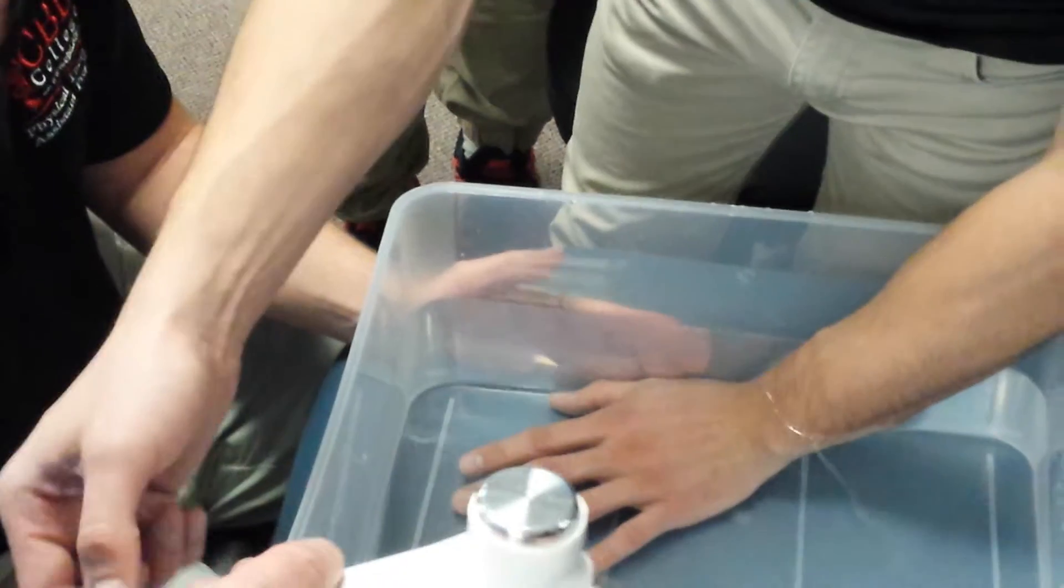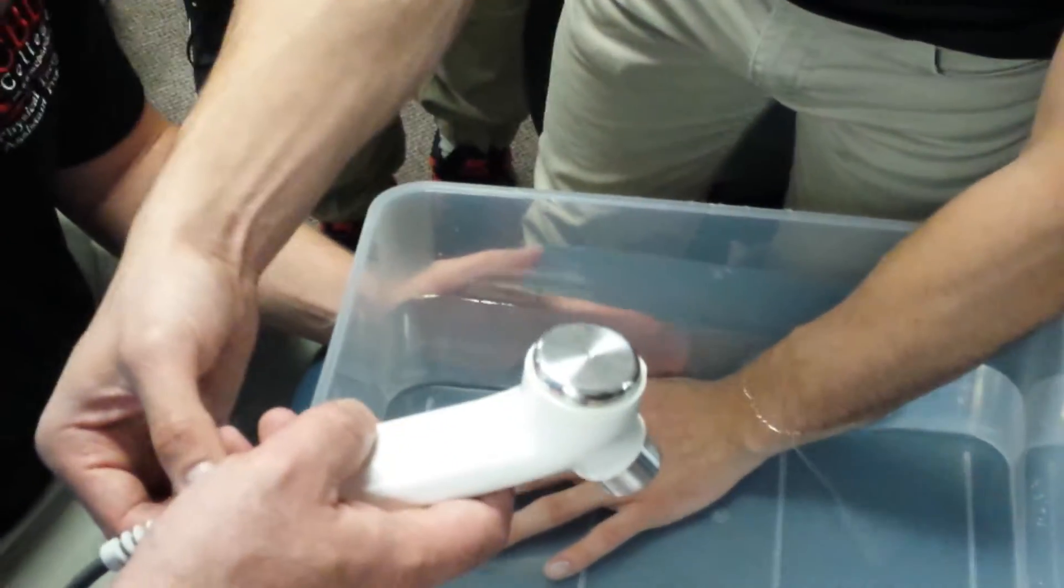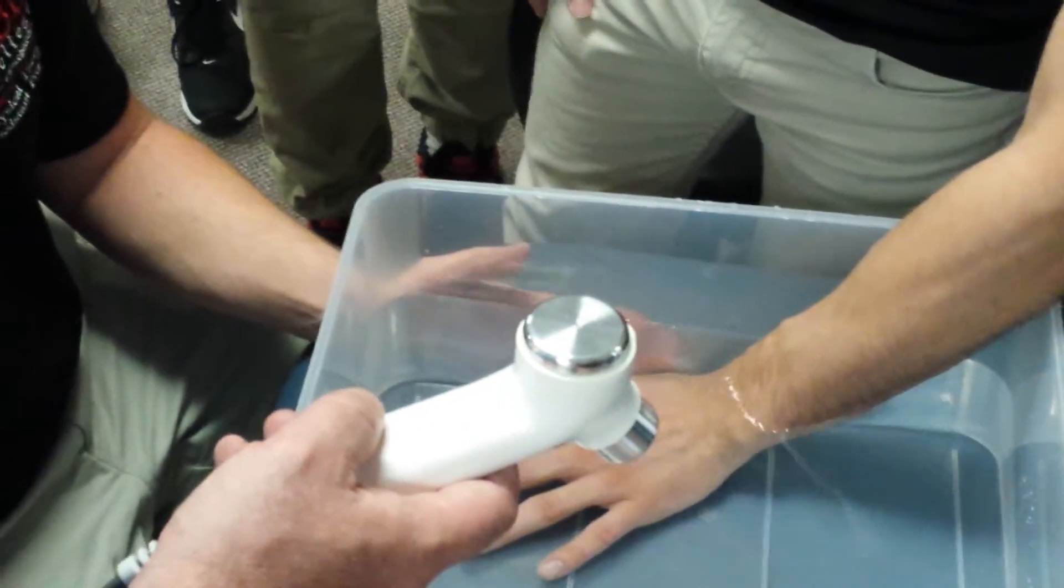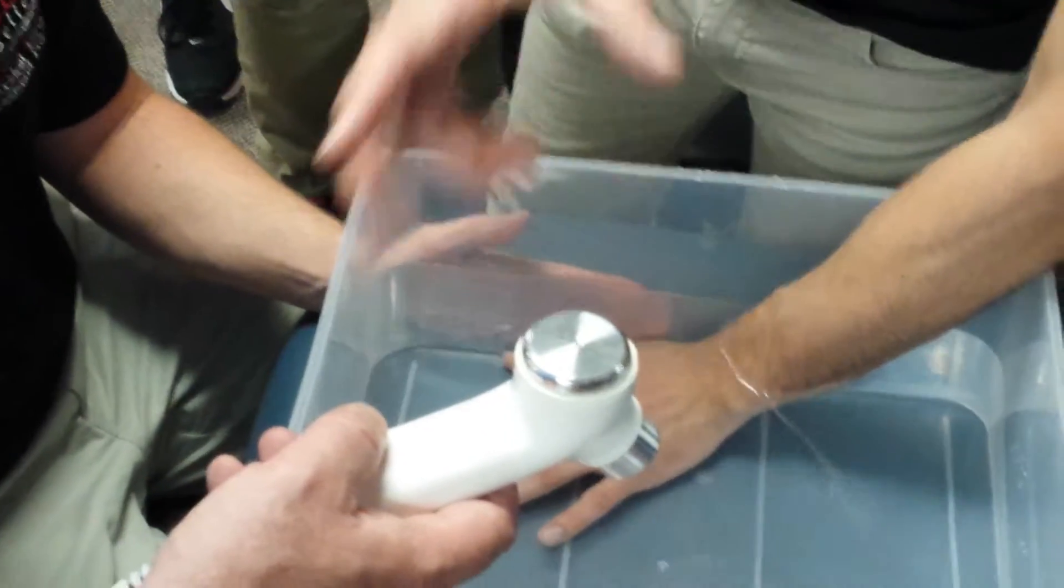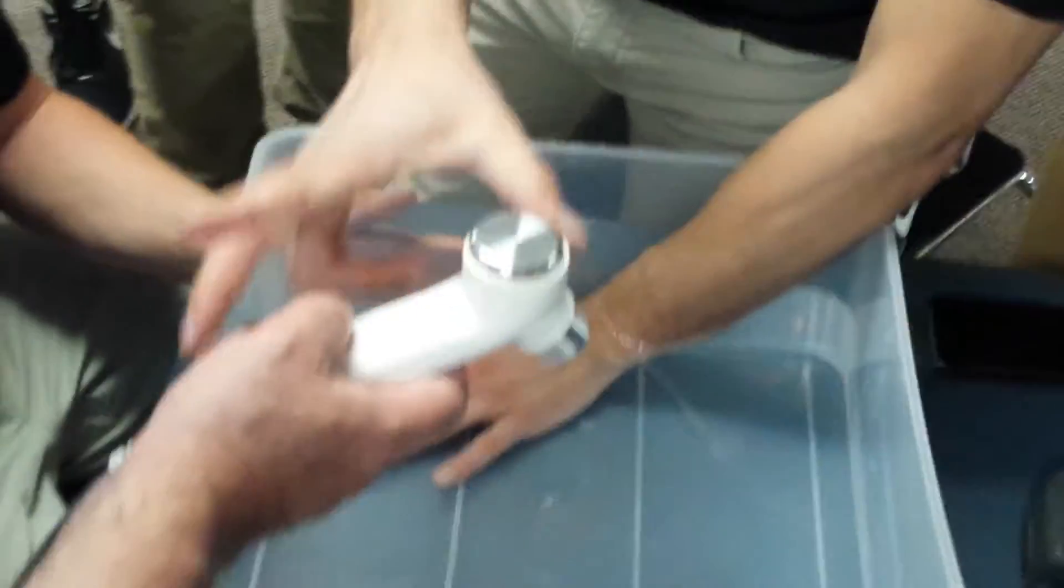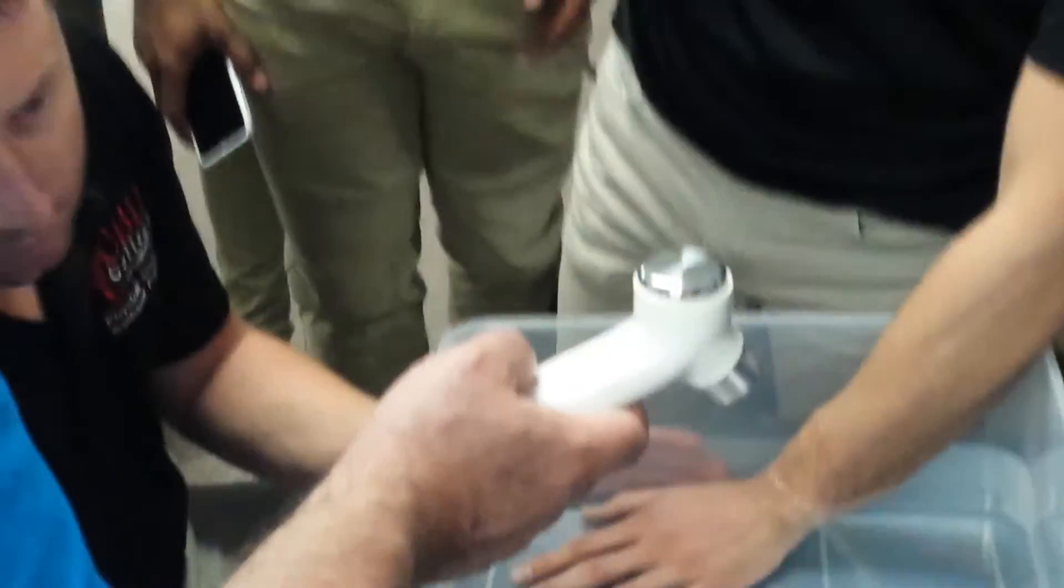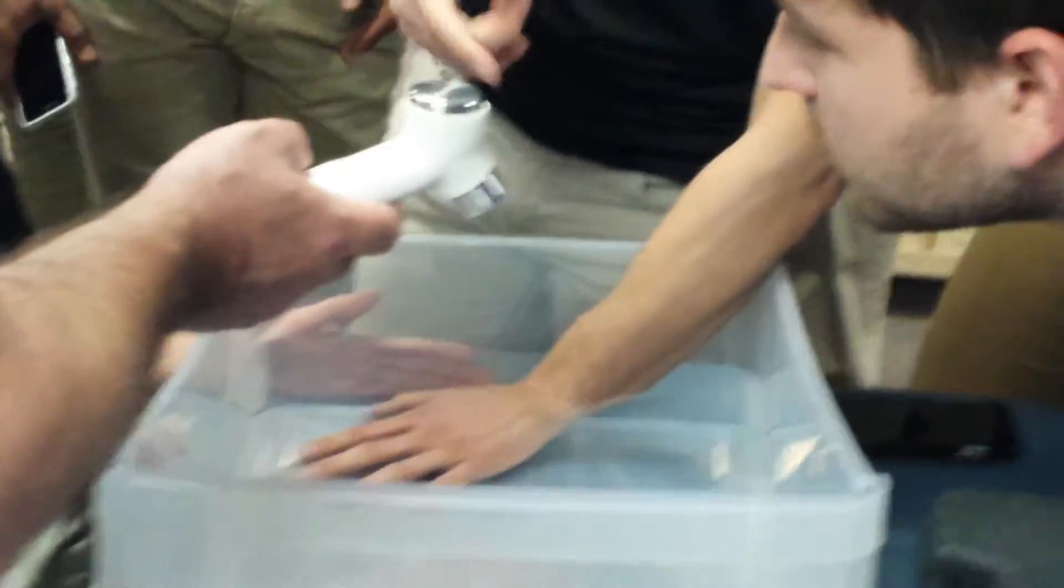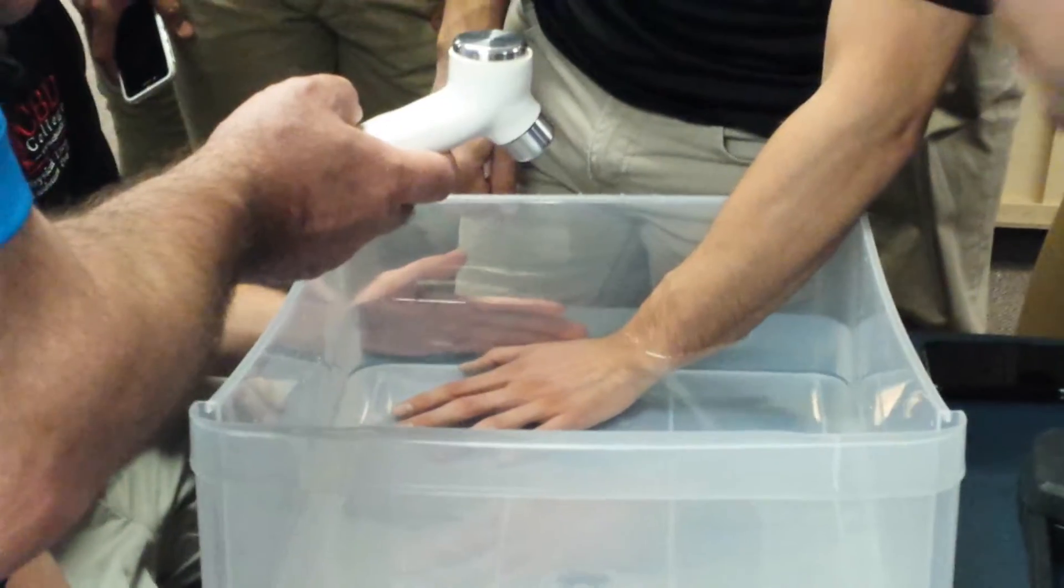Because some of them you have to plug them like directly here on the... like it doesn't look very safe. No. Some of them are like just the unit, just the handle, and you don't have this. You just put the other end on the plug. Okay. And they don't look very made for the water.